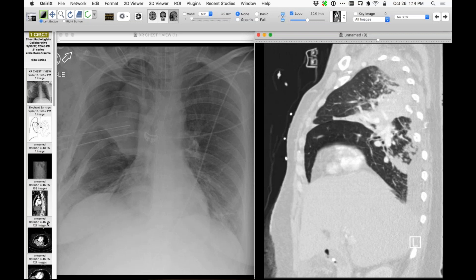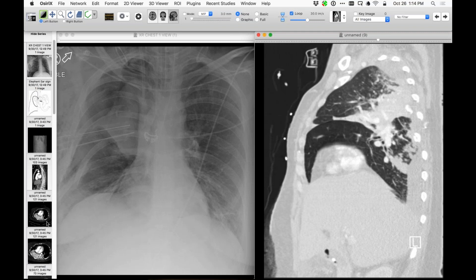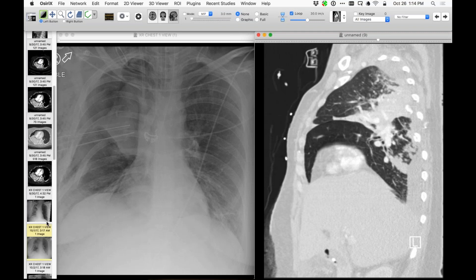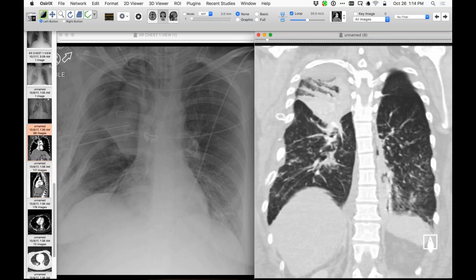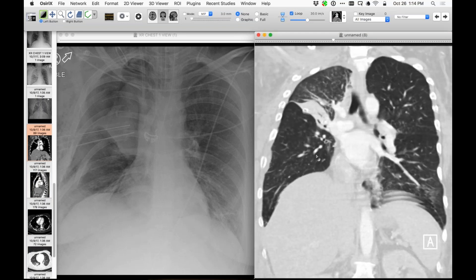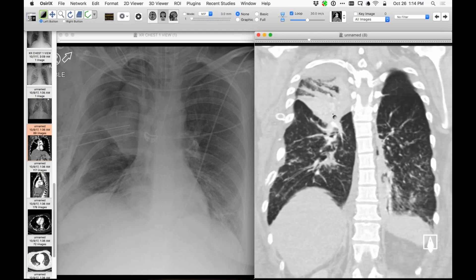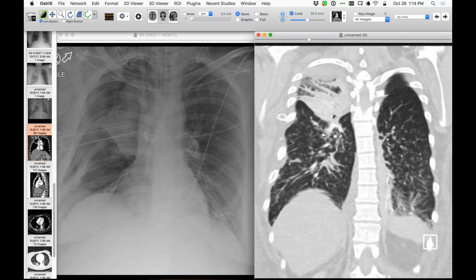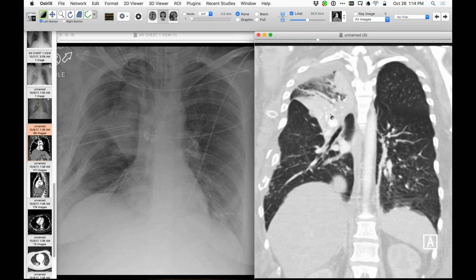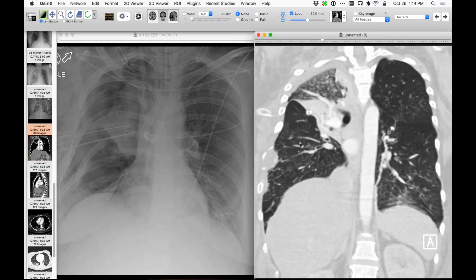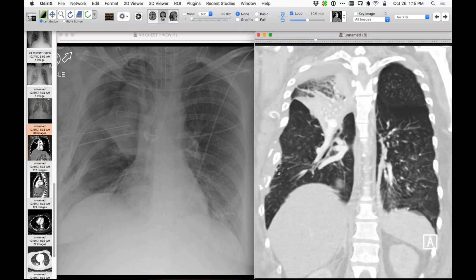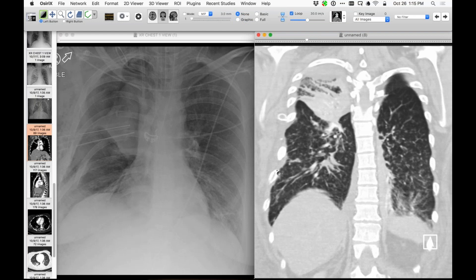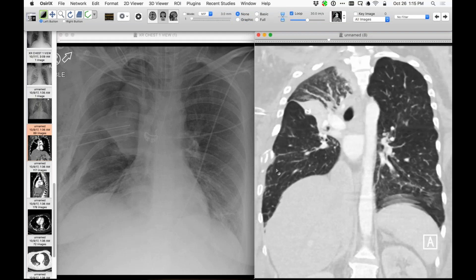Got it. Let me bring back this one. Notice that we have two fissures — the upper one is the minor fissure, and this is the major fissure here. I think a similar phenomenon was present at this time as well, one fissure being the major and one being the minor. Because otherwise this looks like the elephant ear sign, and there's clearly an interlobar fissure between this opacity and aerated lung — these are clearly interlobar fissures.